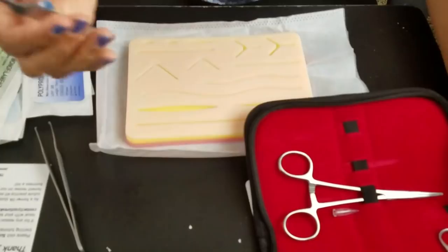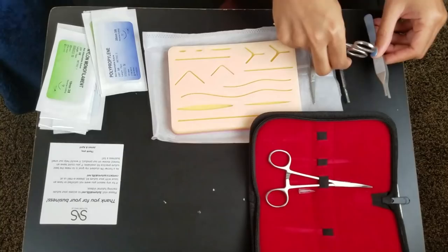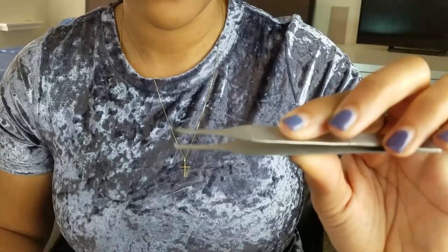So these are the different things that come in the kit. They have some sutures here. I'll need my scalpel, my needle driver, scissors, and my forceps. I remember in my other suture video I talked about these pickups and said I didn't really like them because they had the tooth. But actually I really do like them. When you're suturing in real life with actual skin, these are so much better. They cause less damage — even though you think they're going to cause more damage because of the teeth, you don't have to put as much tension on the skin. I learned that from a really smart trauma surgeon.